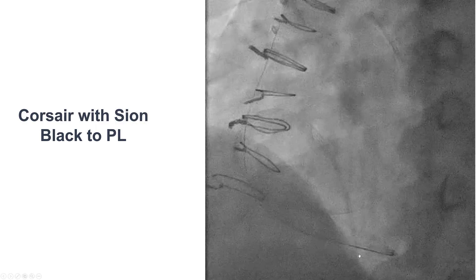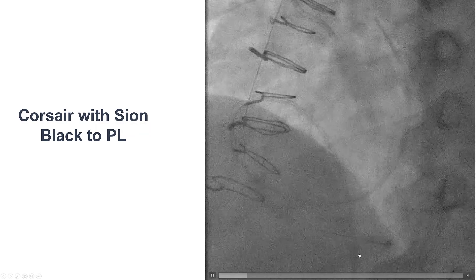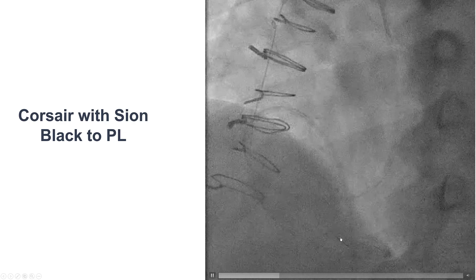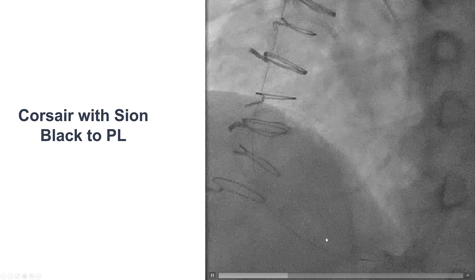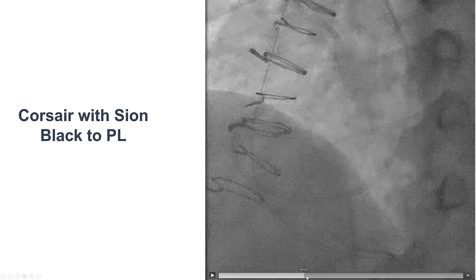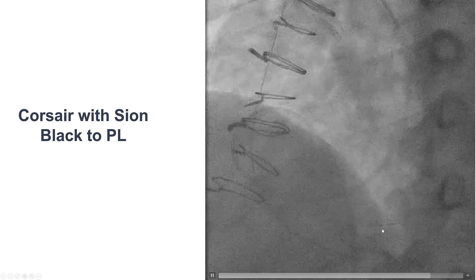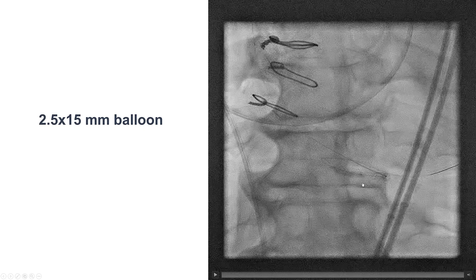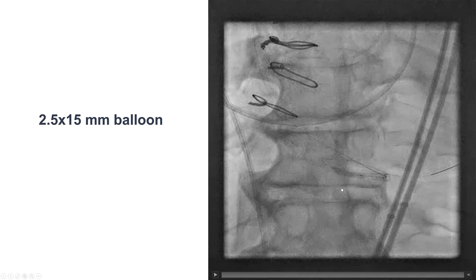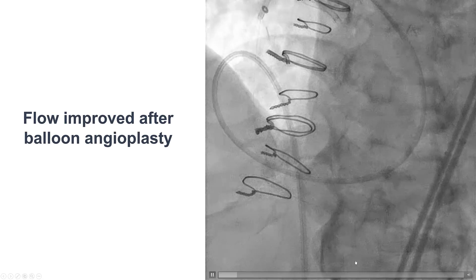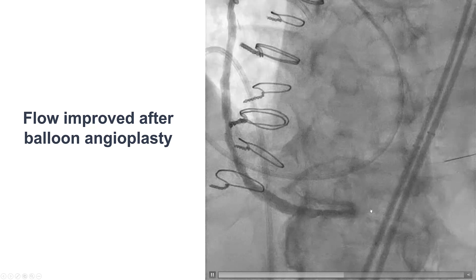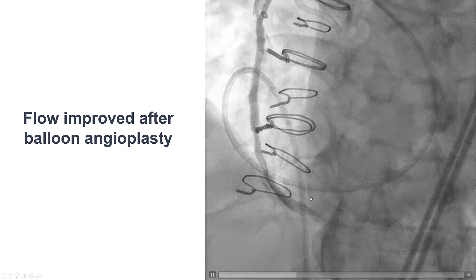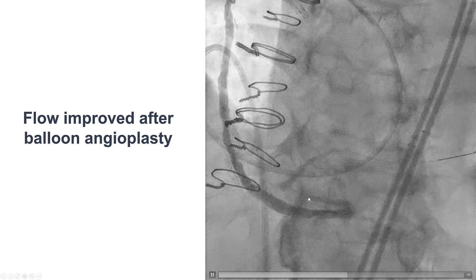We were able to use a Corsair microcatheter and advance a guide wire all the way to the right posterolateral, despite the significant tortuosity. We then performed balloon angioplasty with a 2.5 mm balloon — there was a tight lesion in the PDA. After doing that, TIMI-3 flow was restored into the PDA as well as the right posterolateral.